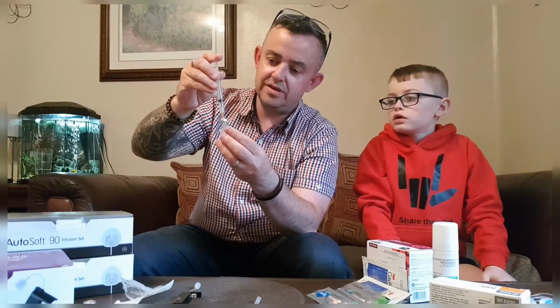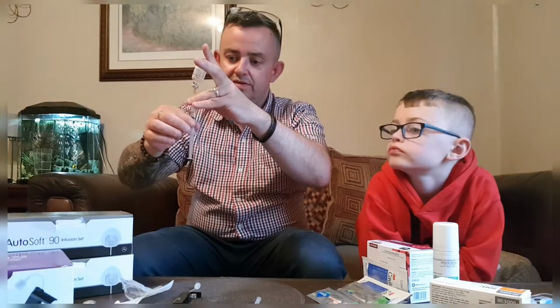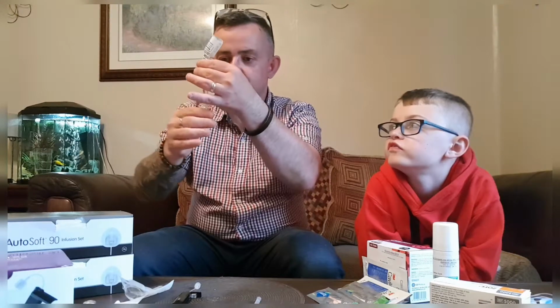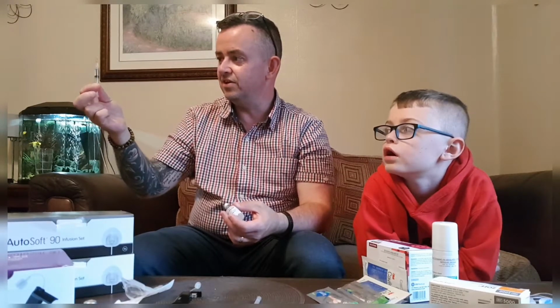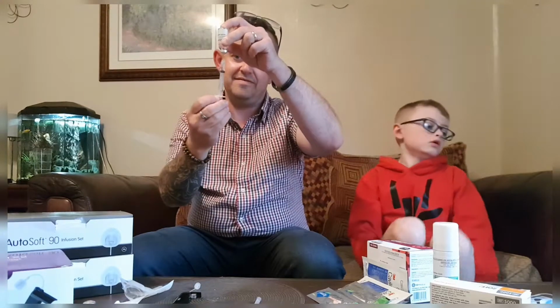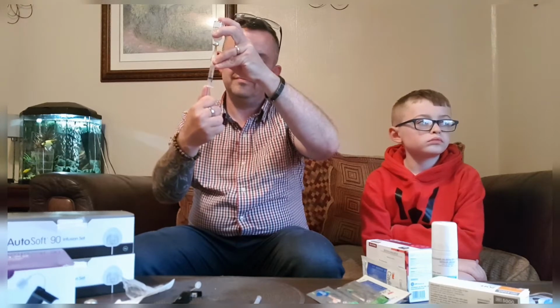Push all that air in there. Should be able to leave that. And pull it right back now. Because I've used 2 bottles, there's a lot of air in there. A lot of air. So let's pull that back. 3 ml.